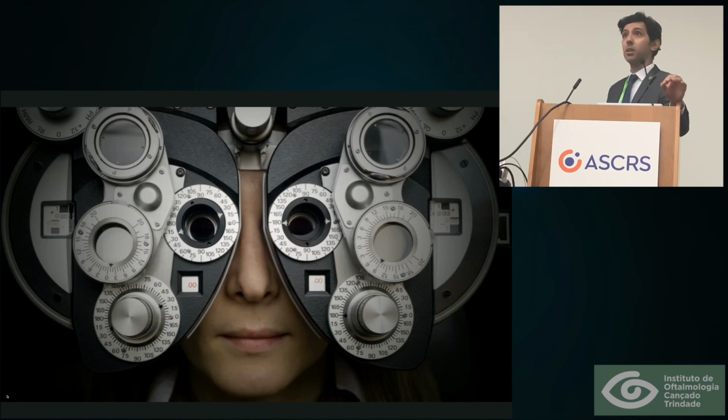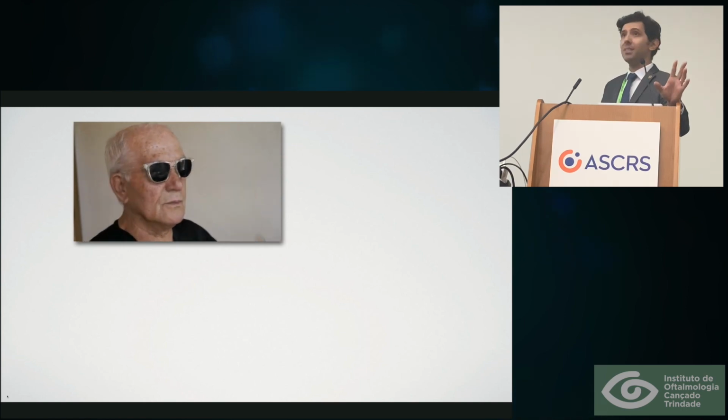So this is another good point to consider when we are thinking about small aperture optics in cases of irregular corneal astigmatism. We have to make a distinction here of the preoperative pinhole acuity test. We should not totally rely on the pinhole acuity test by itself. Of course, this is quite obvious.